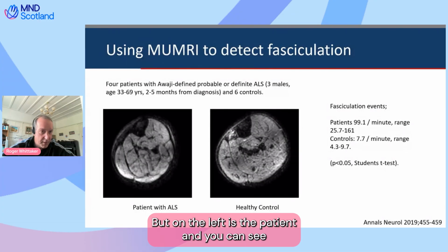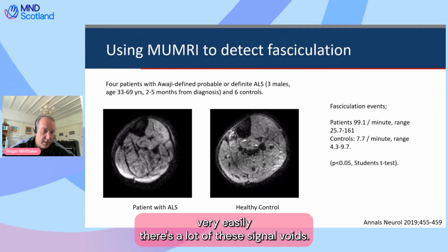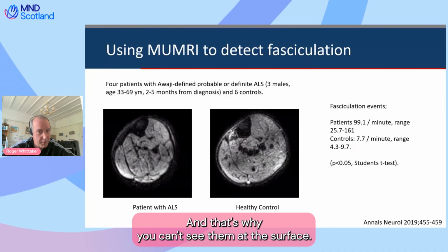But on the left is the patient, and you can see very easily there's a lot of these signal voids. Now, they're quite deep in the muscles, and that's why you can't see them at the surface.